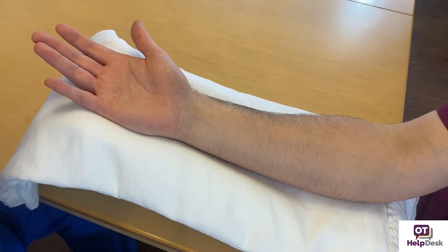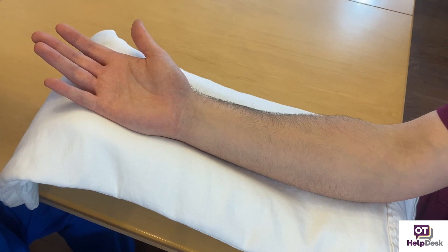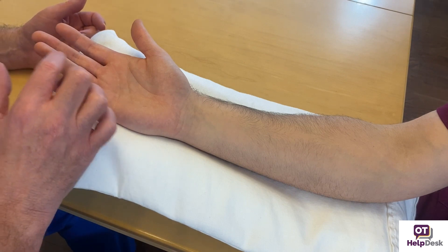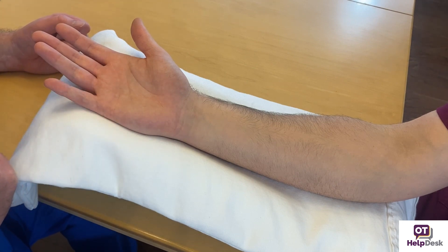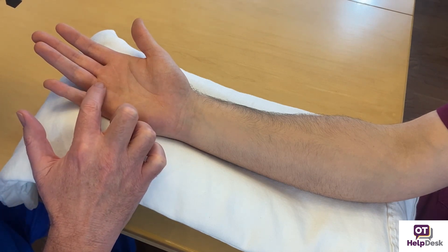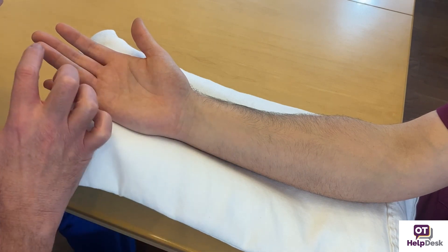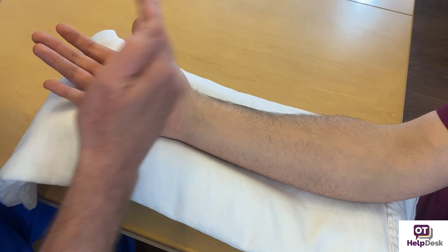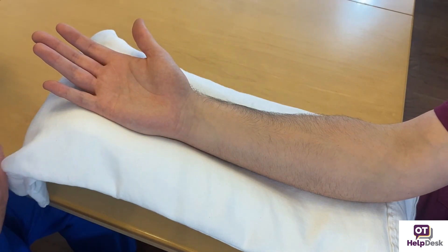Two-point discrimination is a test for receptor density, and you're going to test in the fingertips. One important thing to remember is that we test parallel to the longitudinal axis. You also need to consider that there is a delineation between, for example, the ulnar nerve and the median nerve distribution, and the same can be applied on the radial and median sides of the opposite side of the hand.